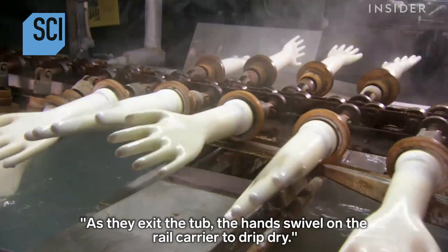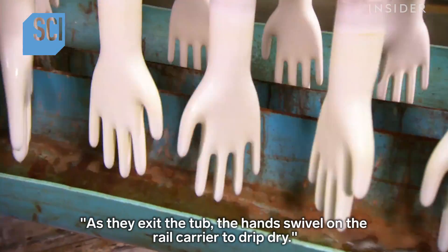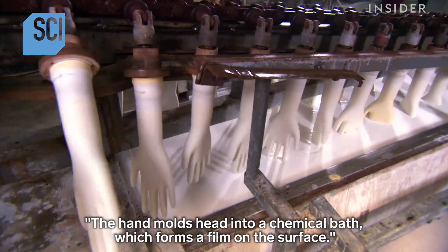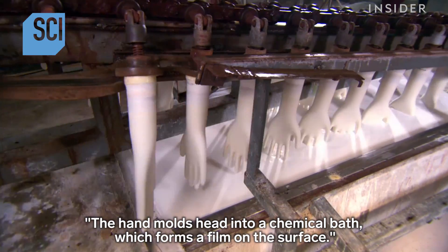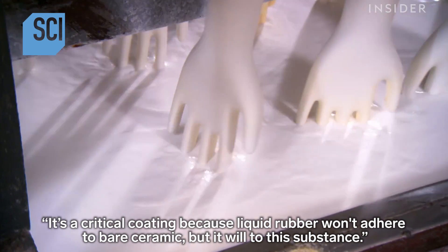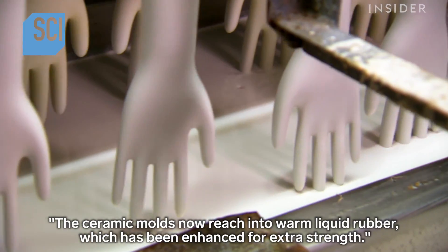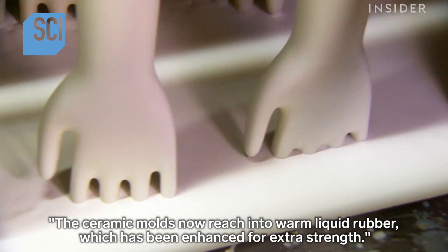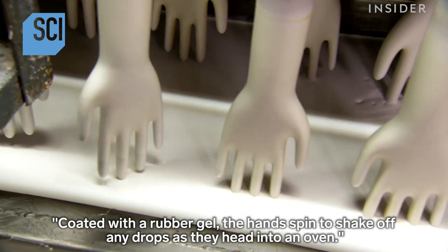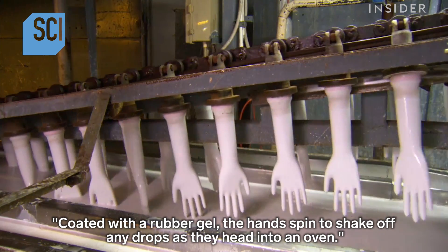After scrubbing, the hand molds dive into a tub of hot water, then swivel on the rail carrier to drip dry. Next, they head into a chemical bath which forms a film on the surface — a critical coating because liquid rubber won't adhere to bare ceramic, but it will to this substance. The ceramic molds then dip into warm liquid rubber, enhanced for extra strength, and the coated hands spin to shake off any excess drops.